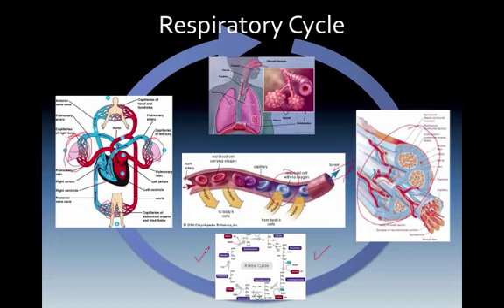The CO2 then is expelled on the red blood cells back through the respiratory system, and then your exhalation is what we see in that. Now the end-tidal CO2's part in this is it takes a look at the CO2 that is expelled and will give us an overall look at this entire process. Are you moving red blood cells through the system appropriately?